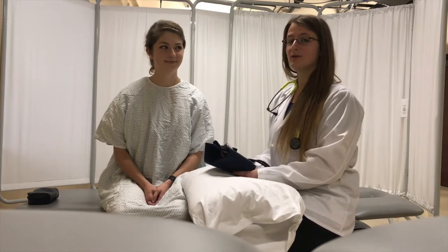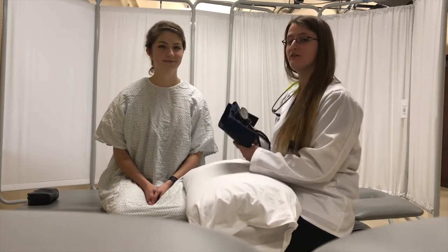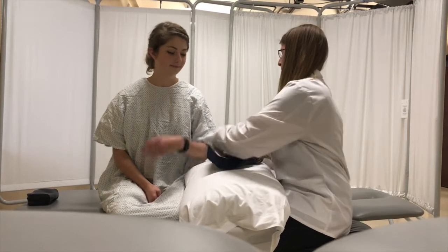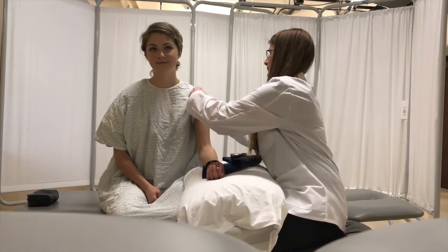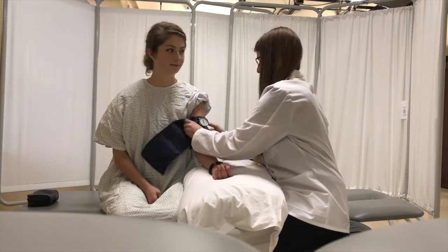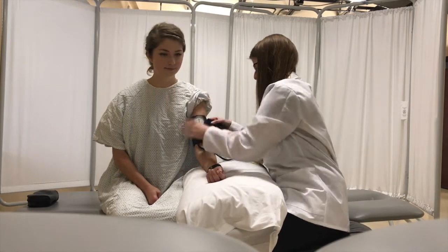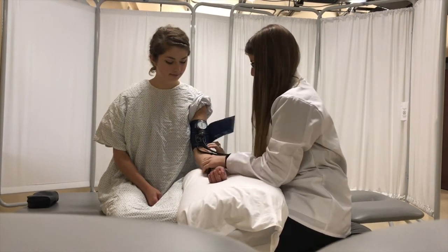Today I'm going to monitor my patient's vital signs to ensure her safety while we work together. First, her blood pressure. Normal blood pressure in adults ranges from 90/60 to 120/80. 140/90 is commonly considered the beginning value for hypertension. Remember, healthy older adults are more likely to have higher resting blood pressure.